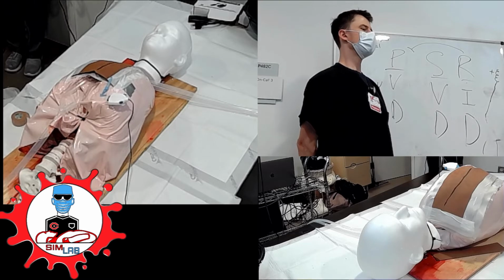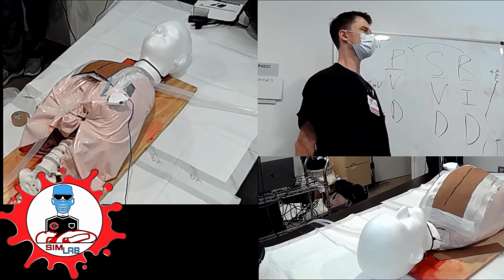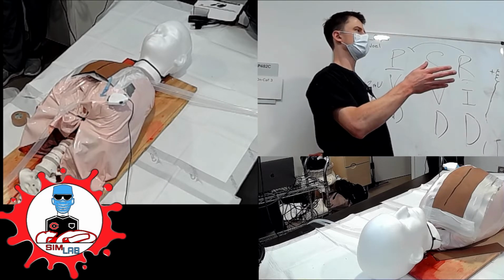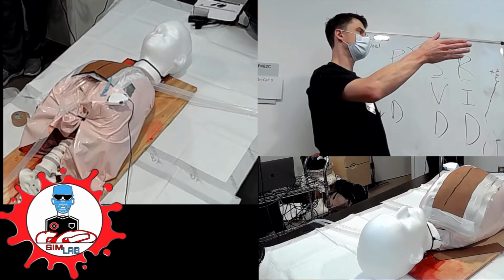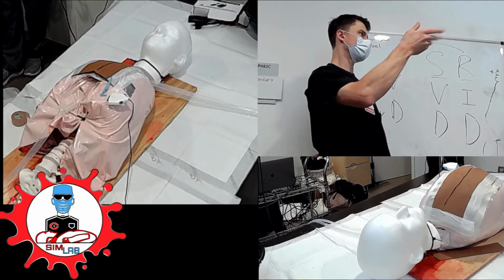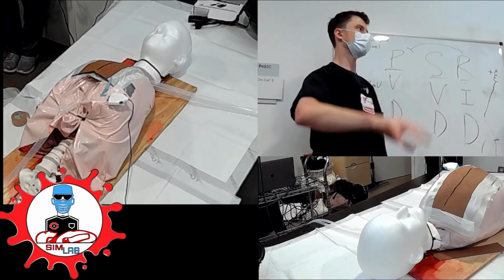If you have a patient who's asystolic, the critical thing is you need a ventricular beat. So if you try to troubleshoot the atrial side, it's possible that they also have third-degree block, and so now you have P waves and atrial contraction, but you have nothing on the ventricular side. So I wouldn't worry about the atrial side. Just go to the ventricular side.